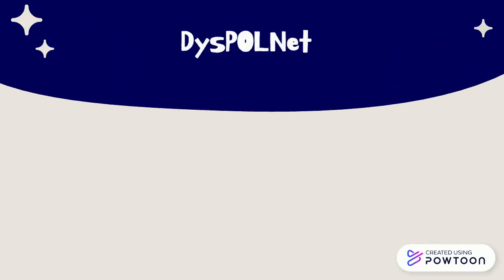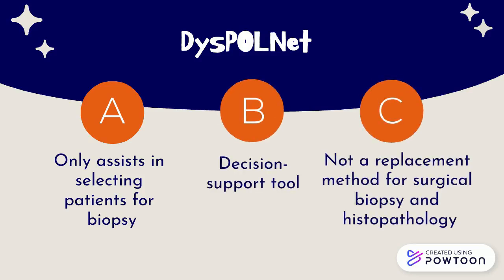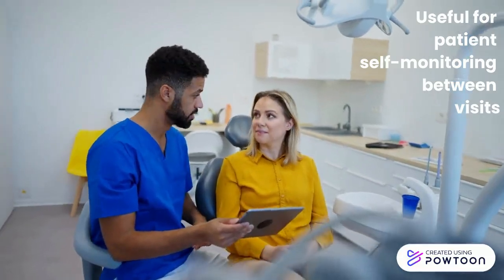To effectively use DysPOLNet, users should note that the web tool only assists clinicians in selecting patients for biopsy and assessing dysplasia for patients who decline biopsy. It is only a decision support tool or surrogate model and not a replacement method for surgical biopsy and histopathology in epithelial dysplasia assessment and grading. DysPOLNet can also be used by patients with oral leukoplakia to monitor their lesions between follow-up visits.